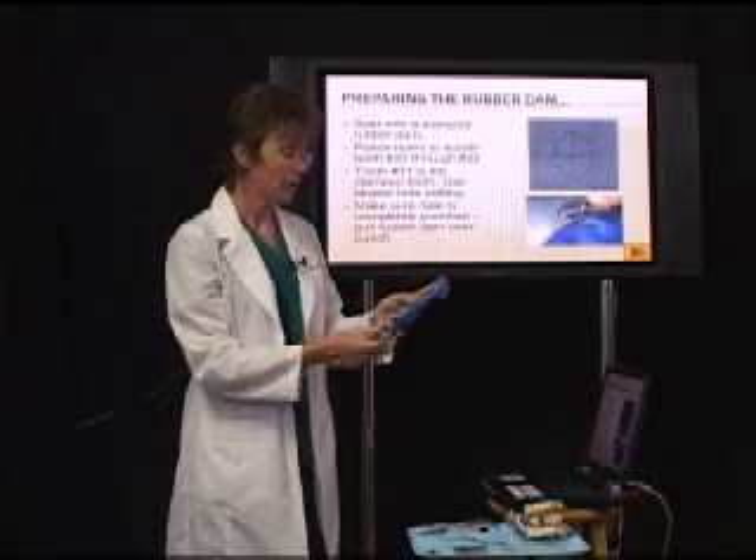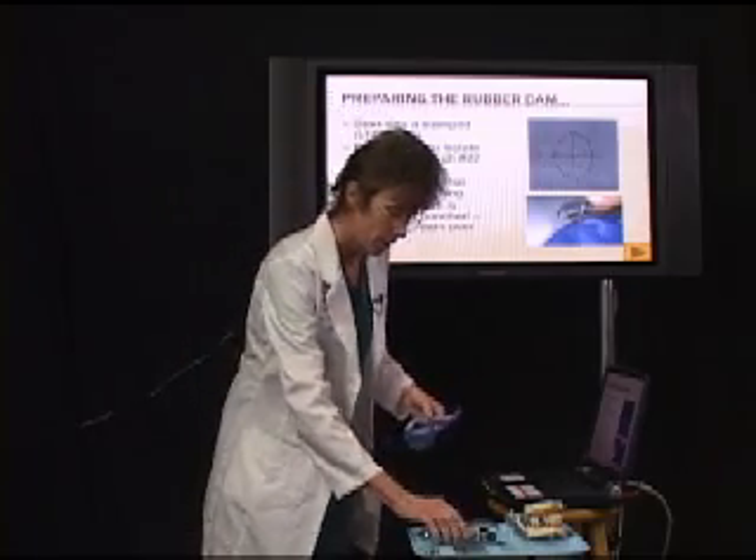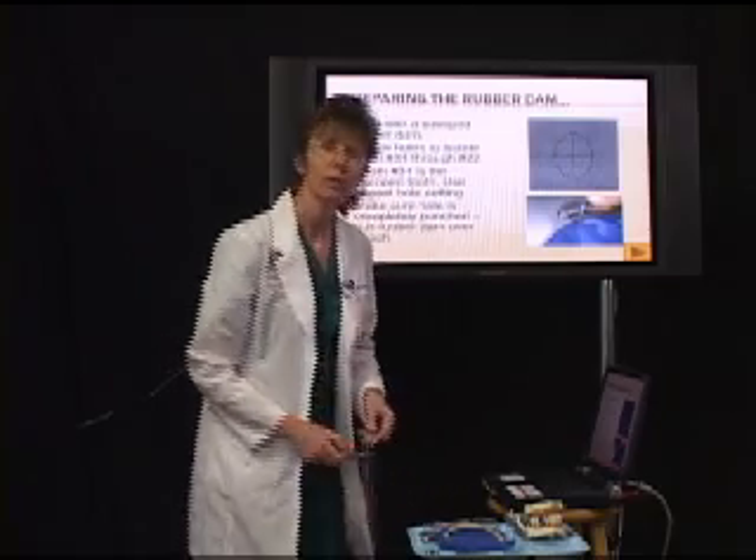When you punch the hole for tooth number 31, the one that we're going to clamp, make sure that you use the largest hole size for that area.